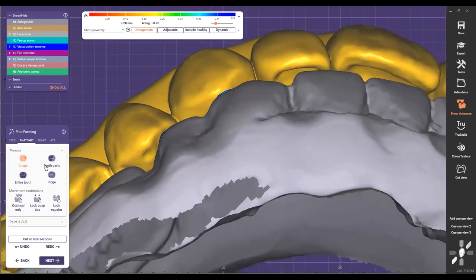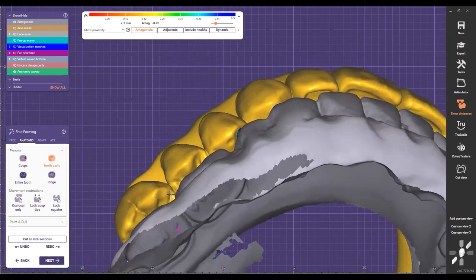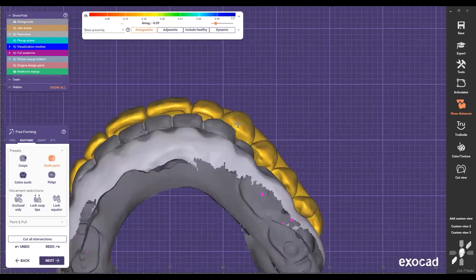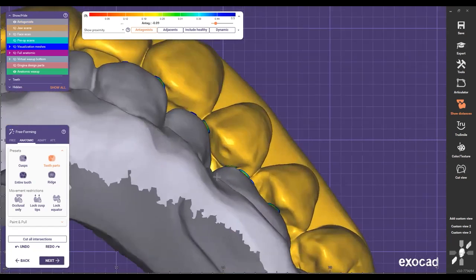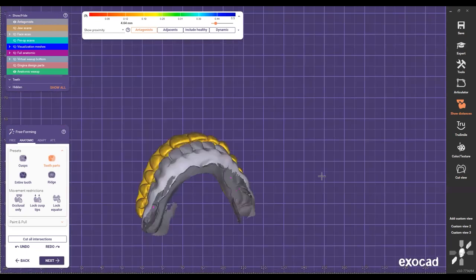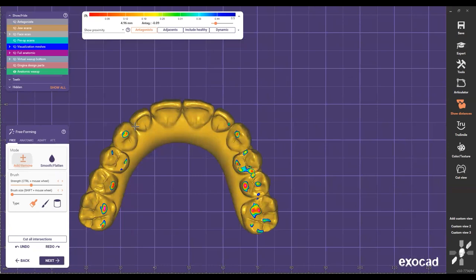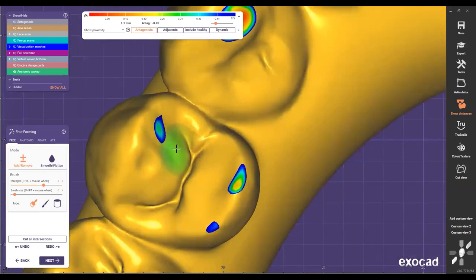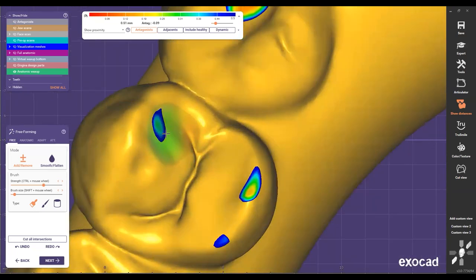And I'm going to try to make sure that I get an ideal overjet here on my teeth, so the patient is not going to be biting the tongue all the time. So I just bring it out, bring it out, bring it out, and then just this out a little bit there. So I say, okay, now everything looks beautiful, ready for my occlusion, start adjusting. And this is my handpiece, right? In the room, I put the articulating paper, tap, tap, tap, and I'm like, okay, I see this occlusion. It's important for you to understand occlusion, because that way you can understand these colors, okay?